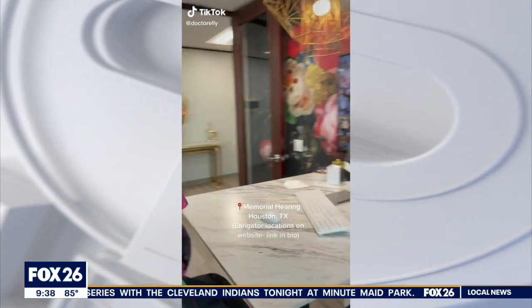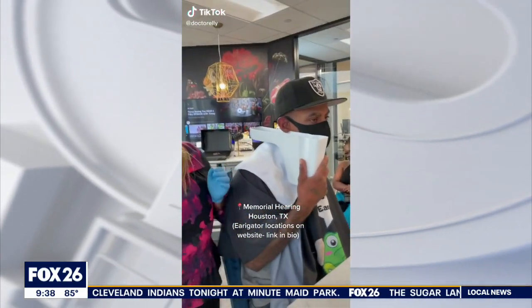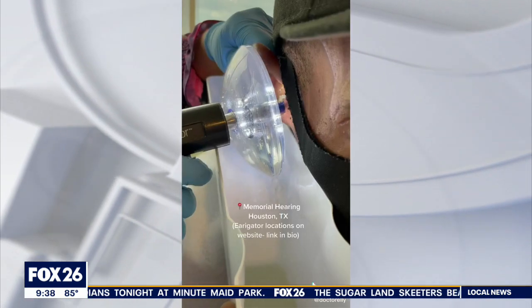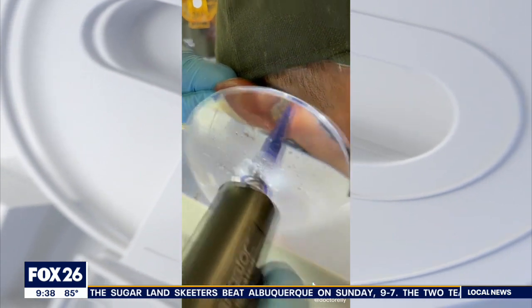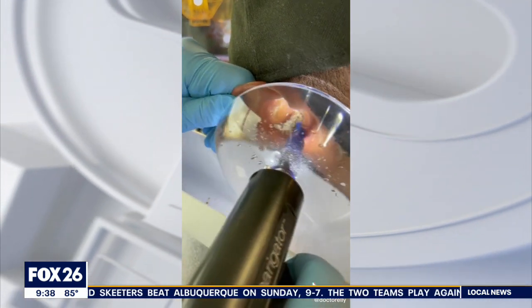The local audiology clinic is going viral on TikTok for its canal clearing procedure called ear irrigation. It's when trapped ear wax is removed with water pressure, oftentimes restoring full hearing for patients. This morning we are live with Dr. Ellie at Memorial Hearing with a look at how it works.